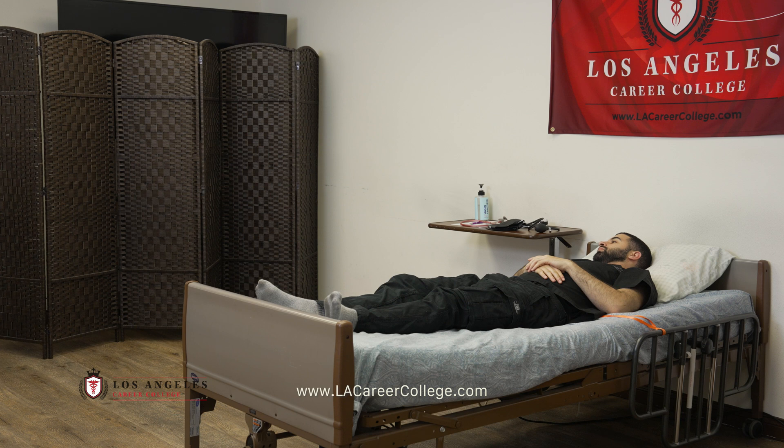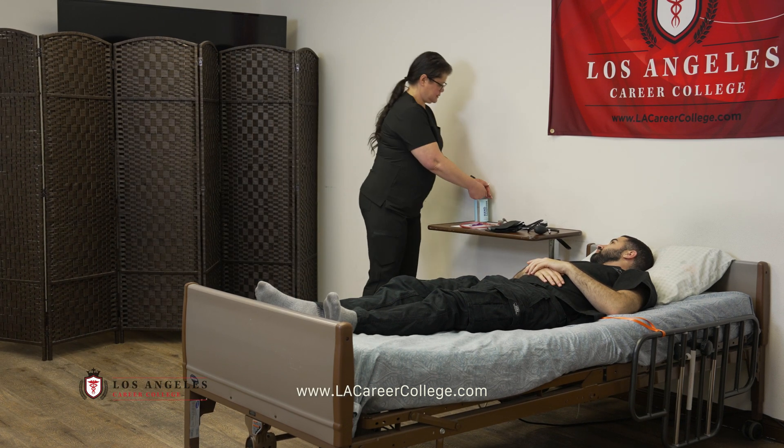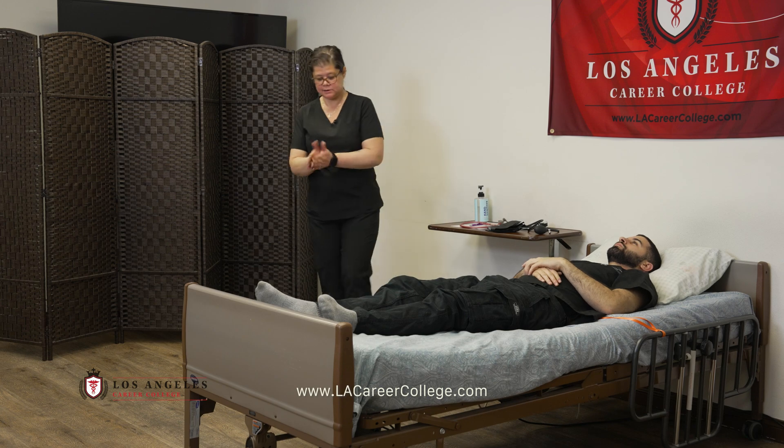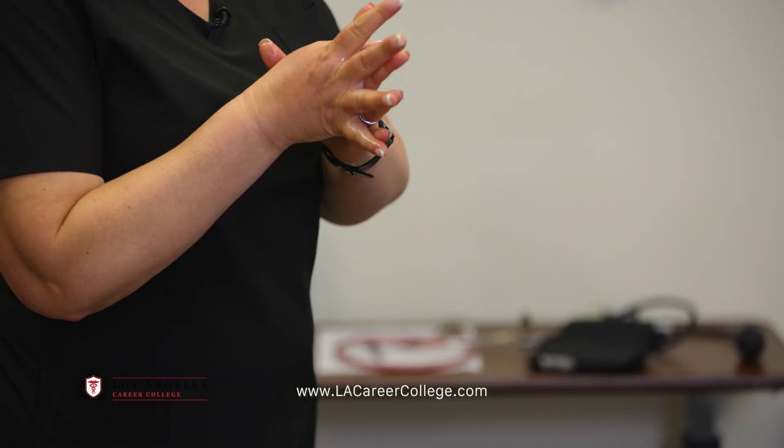May I come in? Provides privacy, sanitizes hands, rubbing all surfaces of the hands until they are dry.